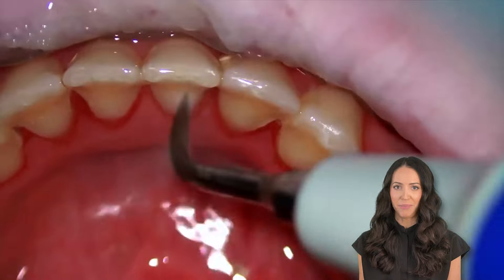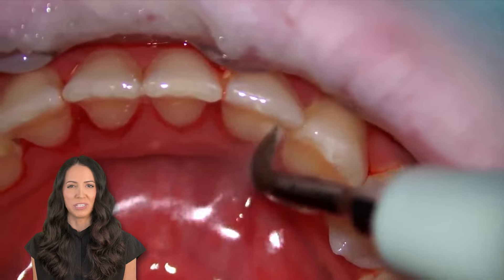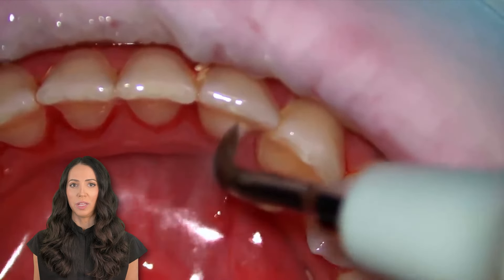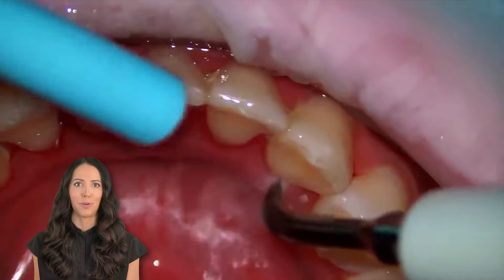A lot of patients usually ask me — it's a good question — do you have to use the regular scalers, the scrapers, after? And the answer is generally yes. For the most thorough cleaning, the clinician will use both this ultrasonic scaler and the regular hand instruments, scalers, scrapers.